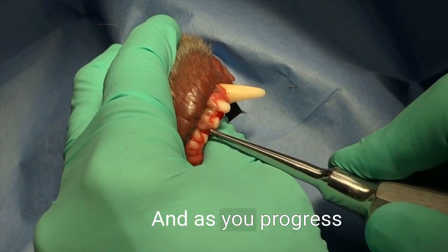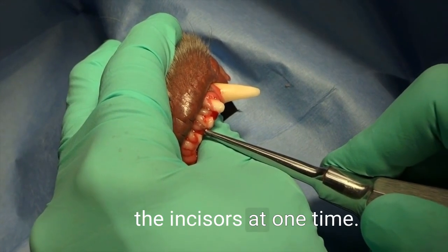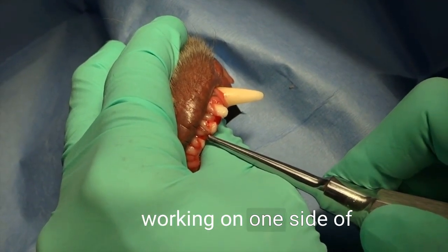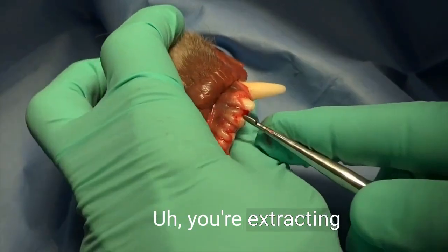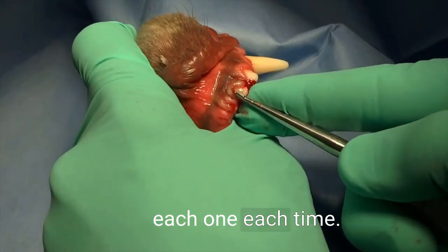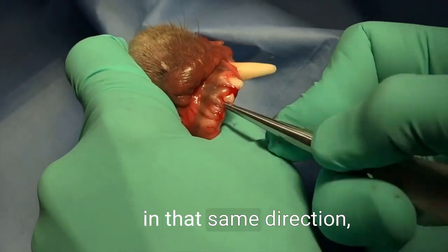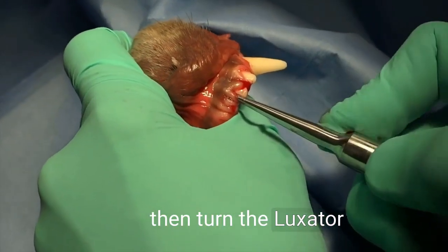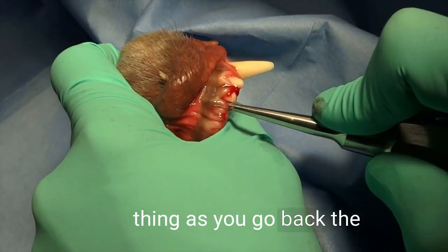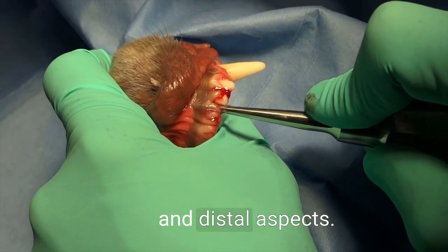As you progress through, you can use that technique on all the incisors at one time. If you're extracting all six teeth and working on one side of each one, just go down the row in that same direction, then turn the luxator 180 degrees and do the same thing as you go back the other way on each tooth — working on the mesial and distal aspects.